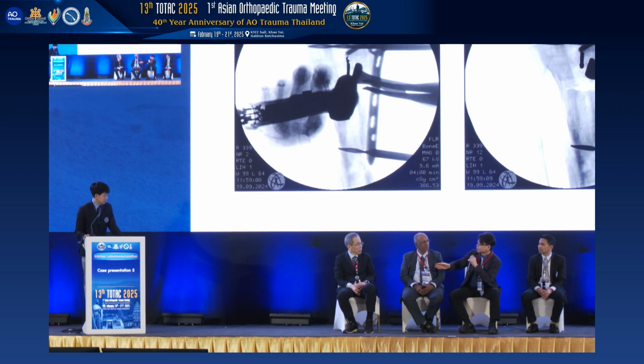Then after the osteotomy, we can correct the AP, and then automatically we correct that. Also, if we have a distraction on the medial side, we can automatically correct the varus. Then put the suprapatellar nail, and if it is not enough for stability, we can add another plate. Yeah, thank you for so much selfless sharing.